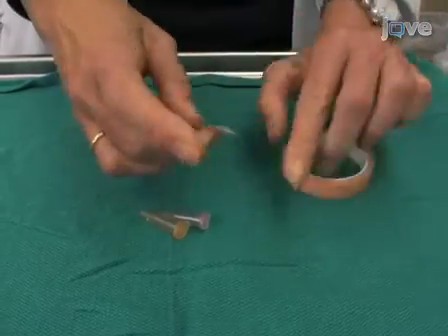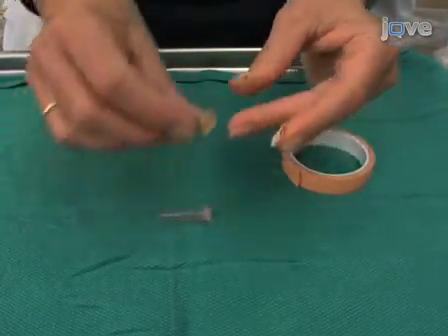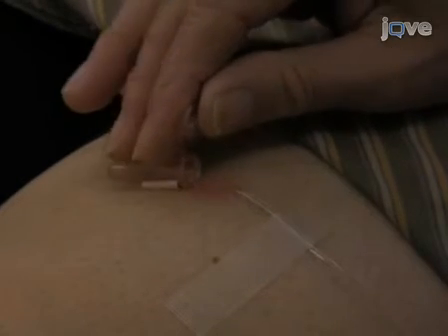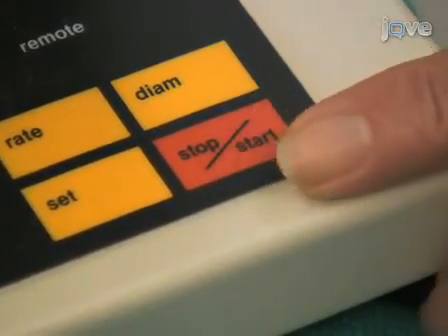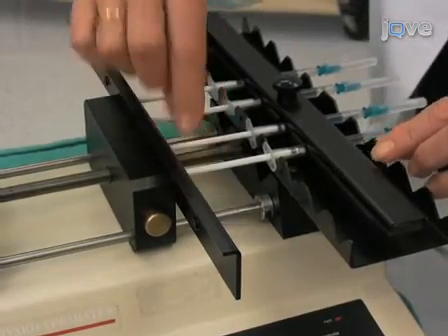Using 1/4-inch pink tape, attach the prepared 1.5 milliliter microcentrifuge collection tube at the skin, close to the exit side of the catheter. Place the tip of the catheter into the collection tube to allow collection of microdialysate. Start the perfusion pump at the predetermined rate and intermittently check that the delivered and collected volume match up.